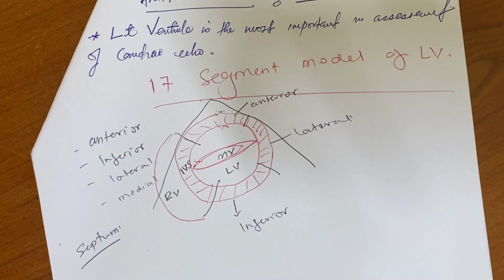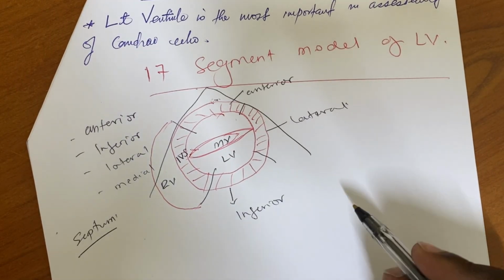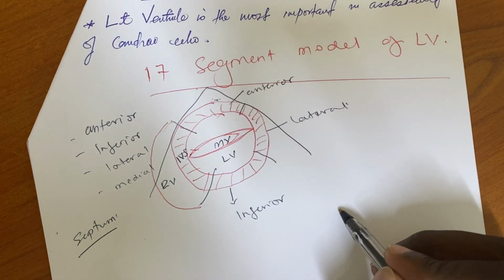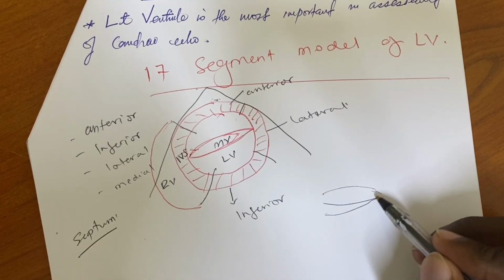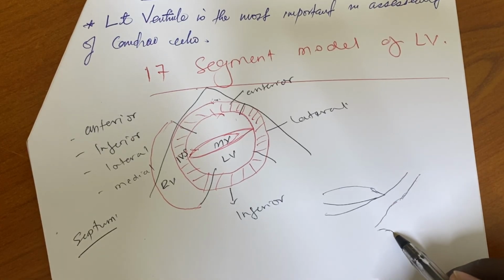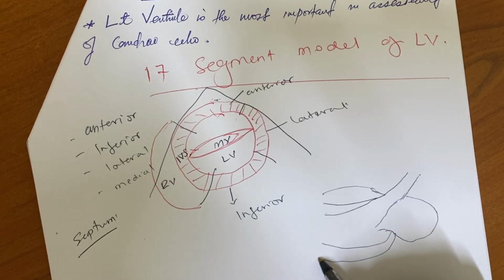But just remember, from the views we did, parasternal long axis. Parasternal long axis is this one, where we were measuring the aortic.